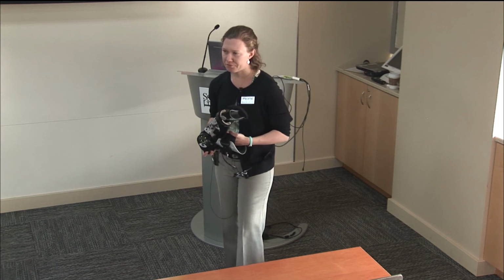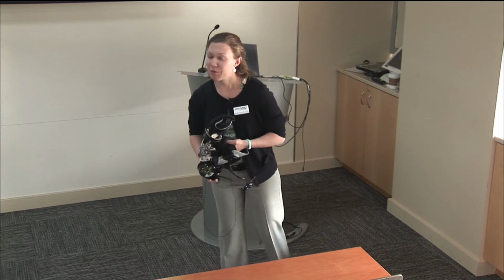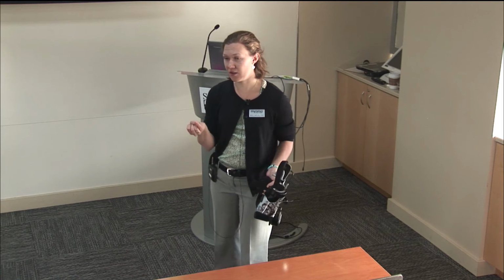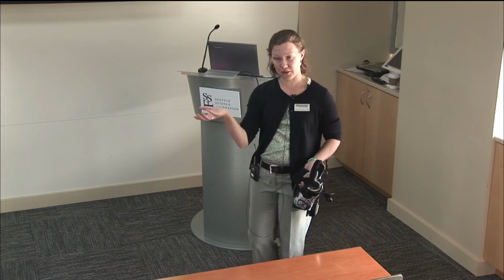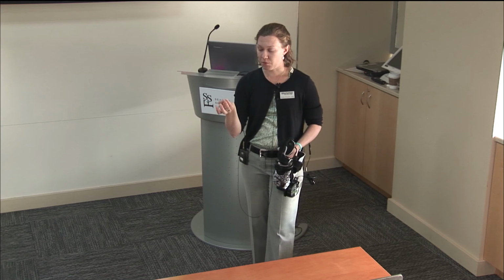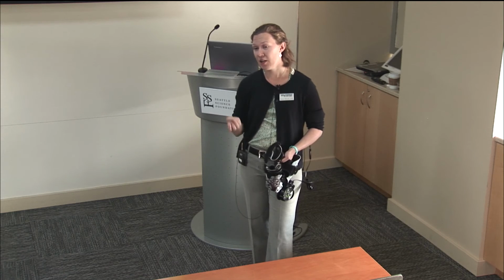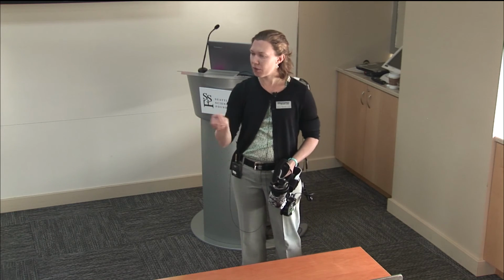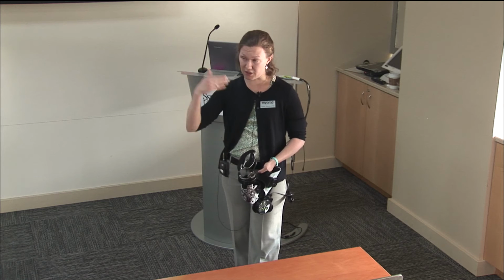And how do, I don't want to monopolize the discussion, how do you prove value? So what kind of questionnaires or outcomes do you have? So we have a couple different things that we're doing. One is we are using the DASH with this. It's the Disabilities of the Arm, Shoulder, and Hand to determine patients' functionality before being fit and then a little bit later. We have also been lately using what we have termed kind of 3 functional tasks, which basically patients have to list out for us, the O&P provider, a minimum of 3 tasks that they want to accomplish. And then again, after, say, about 3 months or 6 months, depending on what's determined by the provider, they will reevaluate to ensure that they're meeting those goals and then set new ones.